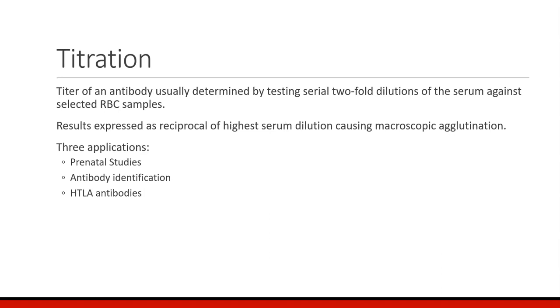Titrations are usually done in reference laboratories because you need to have individuals who do these on a regular basis and who are able to maintain competence and demonstrate competence. In transfusion service, with the exception of HTLA antibodies, we generally don't do them.